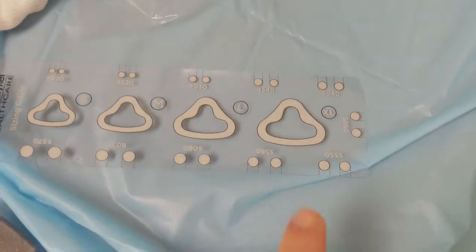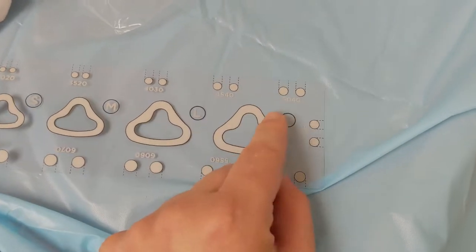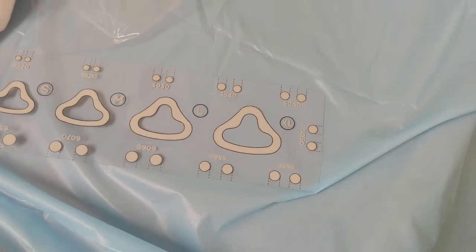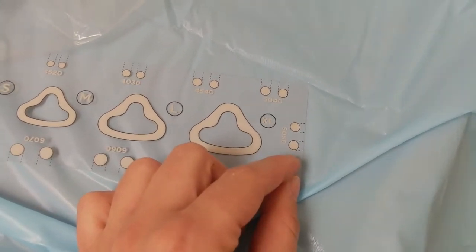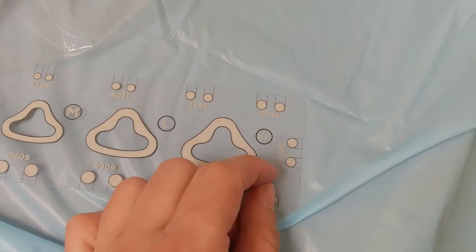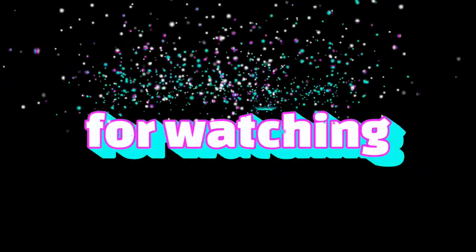Another trick: the first two numbers are the actual nares size, so 45 or 50. The second two numbers are the width between those prongs, which is the septal width. So 50-40 and 50-50 are the same size prongs, but if your septum is looking a little pinched on 50-40, you can increase up to 50-50.